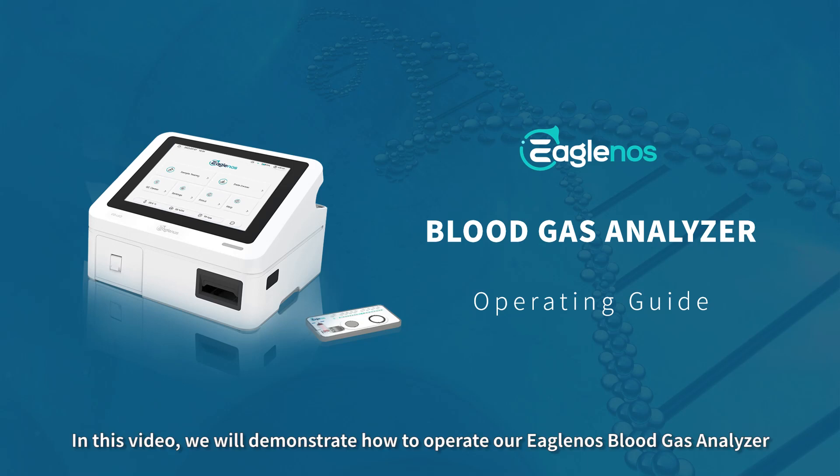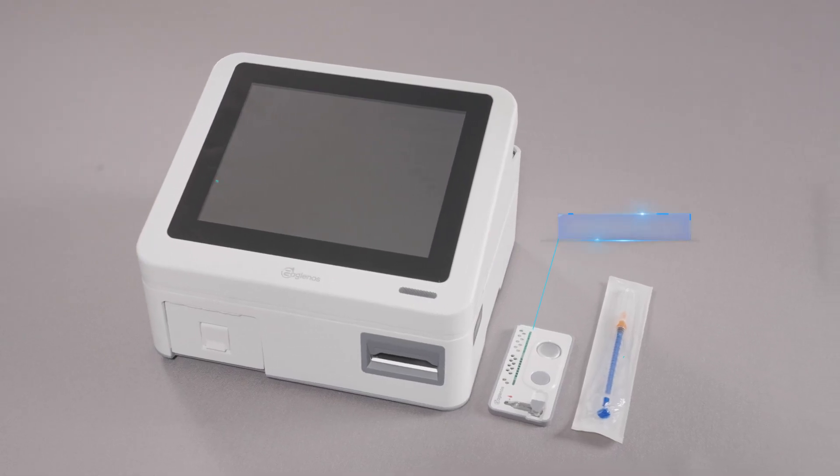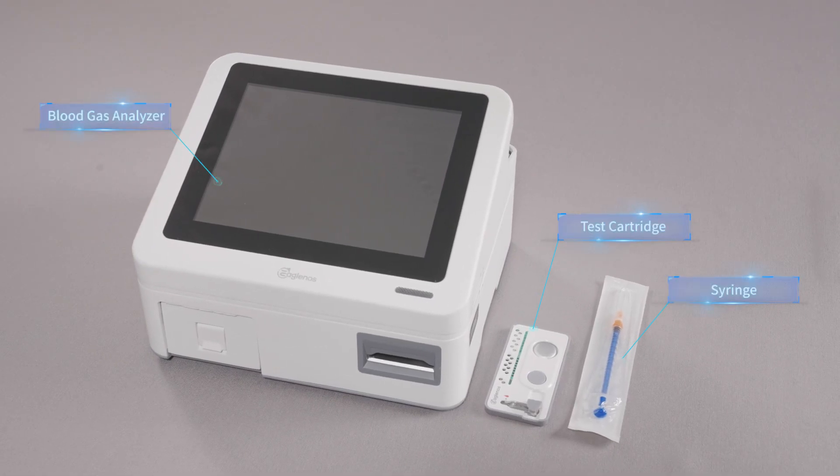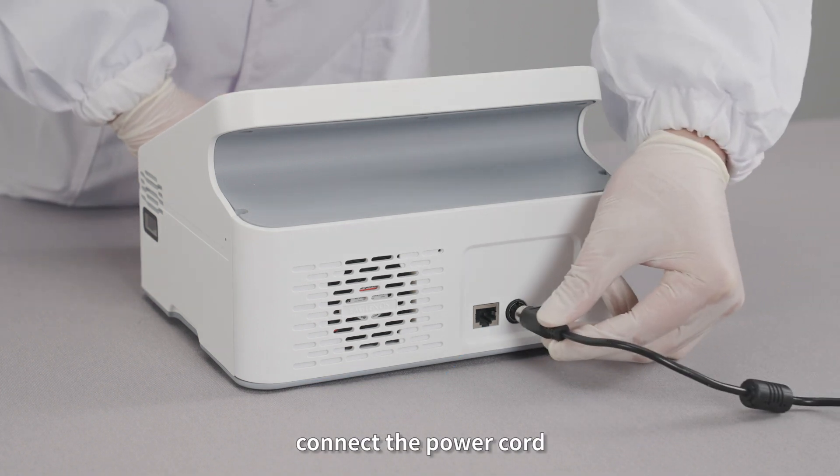In this video, we will demonstrate how to operate our Eaglenos Blood Gas Analyzer. Connect the power cord.